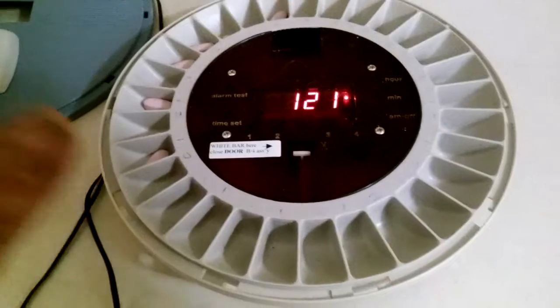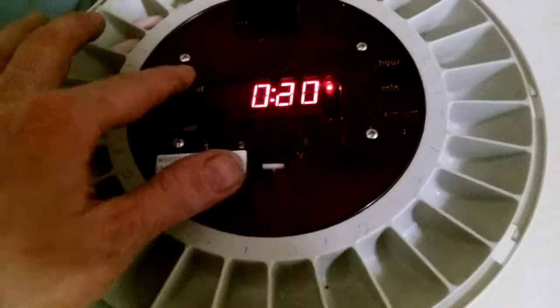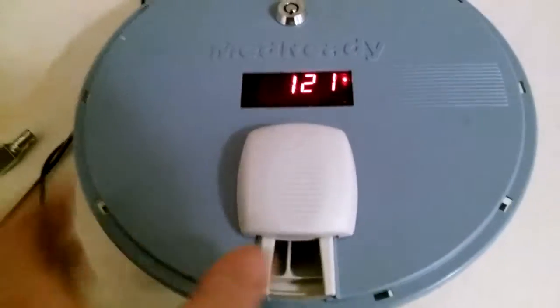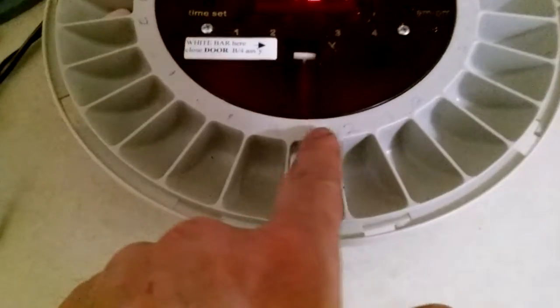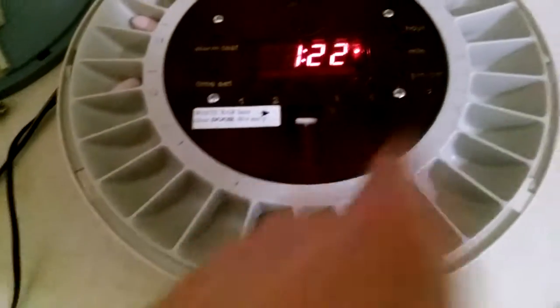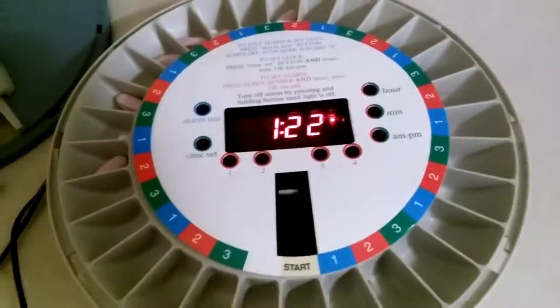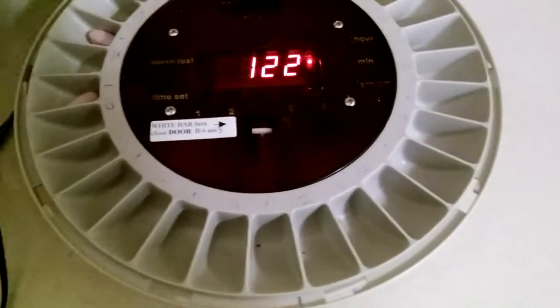If you do it two times a day it will hold a seven-day supply. It goes round and round - push this lever up and it goes off. Since we're doing two times a day, one is morning and two is evening. You can also put a plate over it if you want to do three or four times a day, though four times a day you'll definitely have less time on it. These are pretty dependable devices.